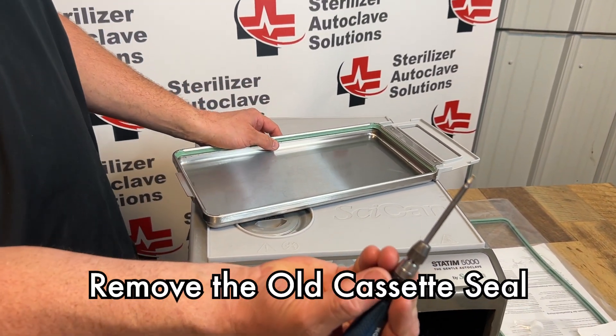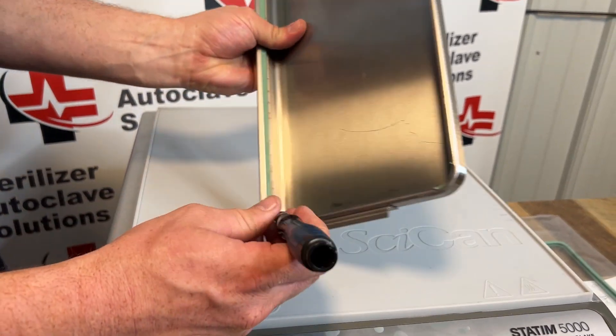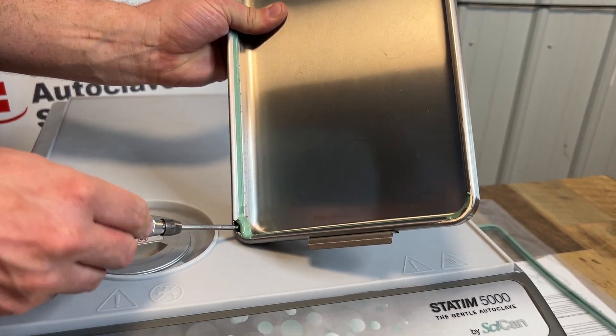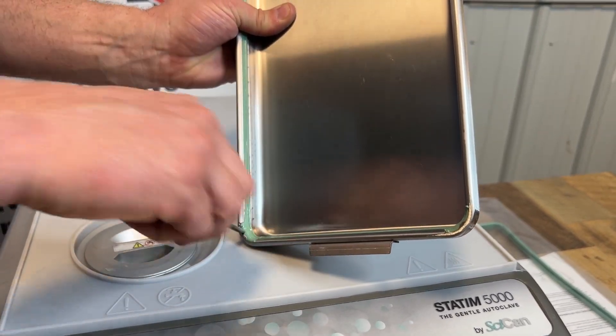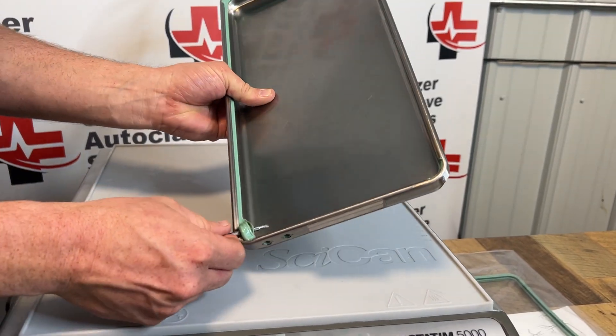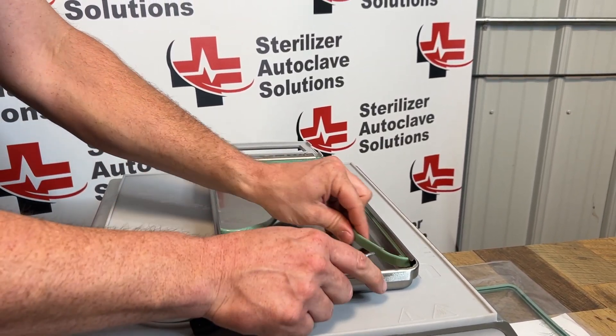Using a small flathead screwdriver, I'm going to put it on the back side of the seal and gently work it out. You try not to stab the seal as you're getting it out. Once it pops out, you can roll the rest of that seal all the way out.